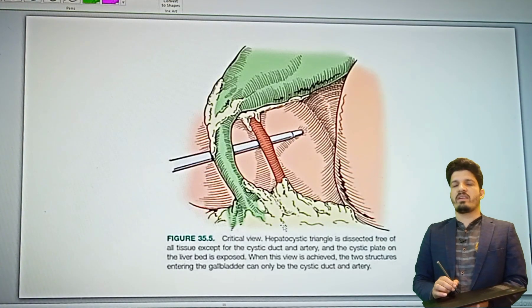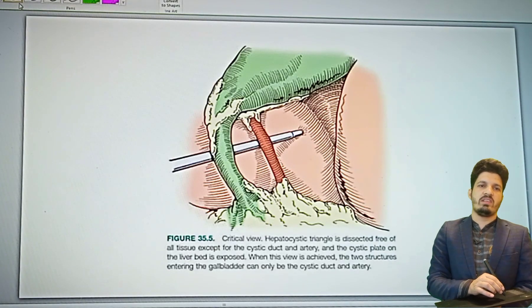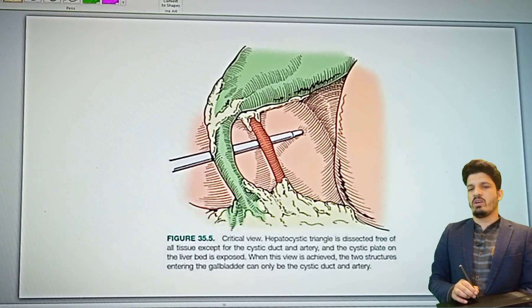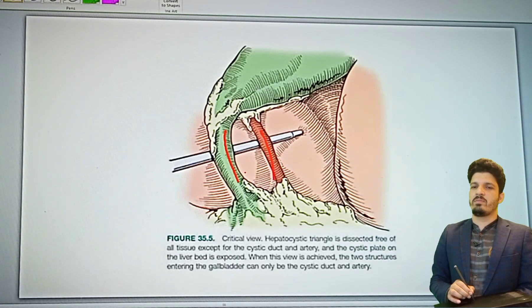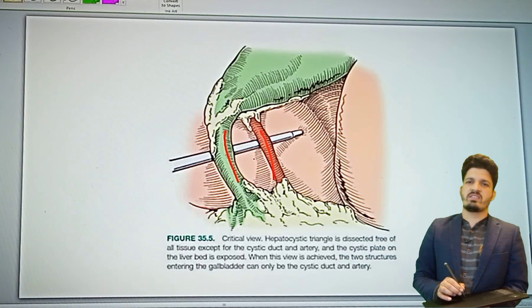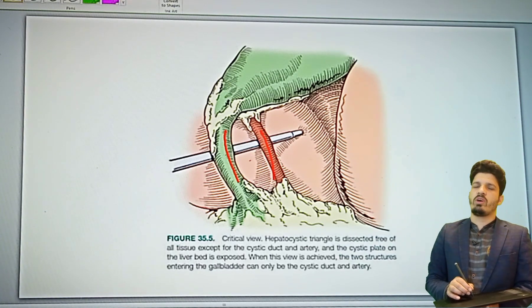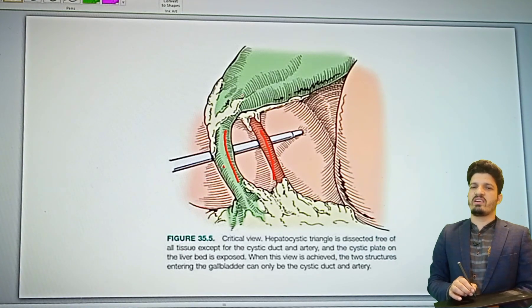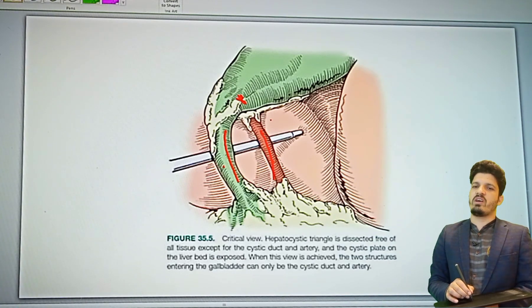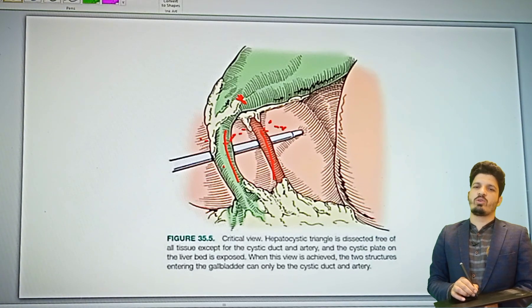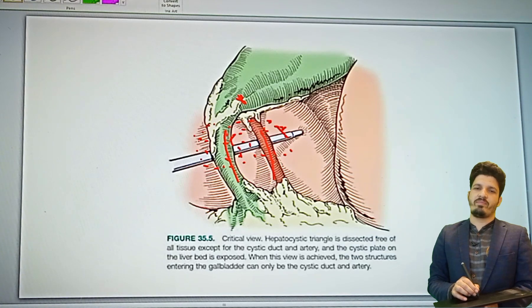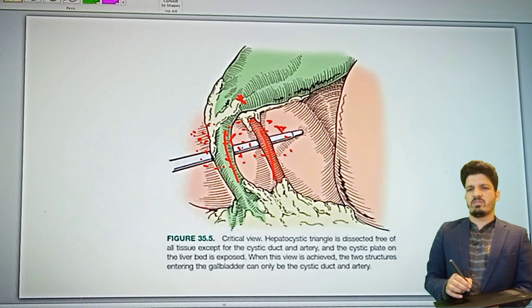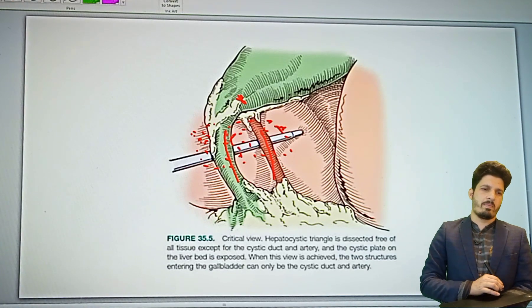Here I am showing the hepatocystic triangle with the critical view of safety. You can easily visualize the cystic duct and the cystic artery — only two structures entering into the gallbladder. The lower two centimeters of the cystic plate has been dissected to expose the posterior liver bed, with meticulous dissection performed here.